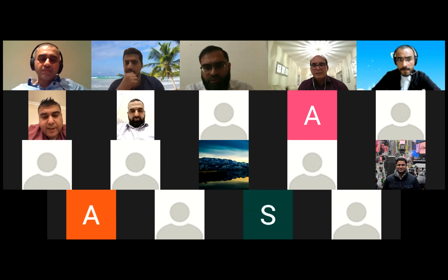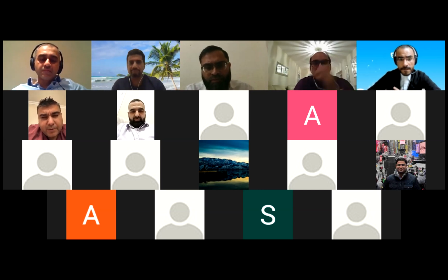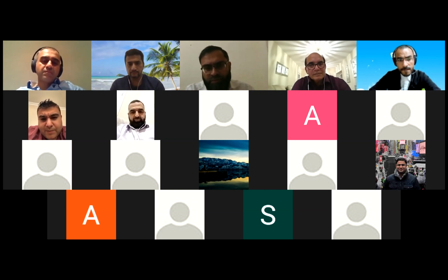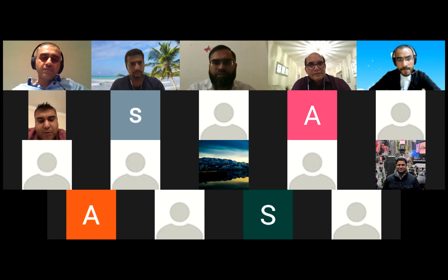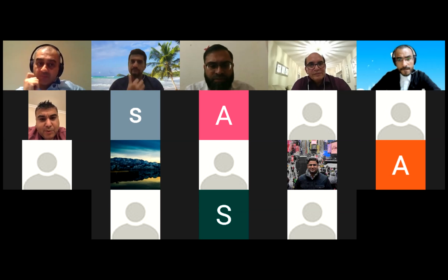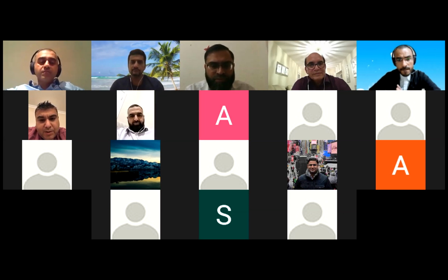So while we're polling, I just want to ask my colleagues about the use of POT balloon size, because sometimes, depending on how much distance you have left between the carina and the bifurcation in the left main, the smallest balloon length is 6 millimeter. So if you are using a POT balloon which is 6 or 8 millimeter, you can still disrupt all the hard work of kissing balloon and the carina by doing a POT. So I think it's important for trainees to leave a good distance, a 6 to 8 millimeter balloon length, before the bifurcation as well for doing a good POT.